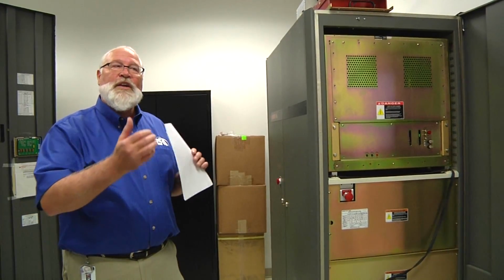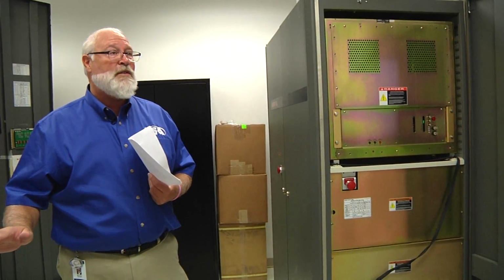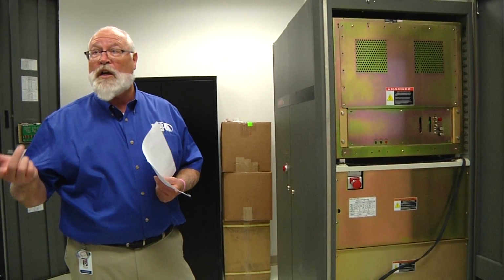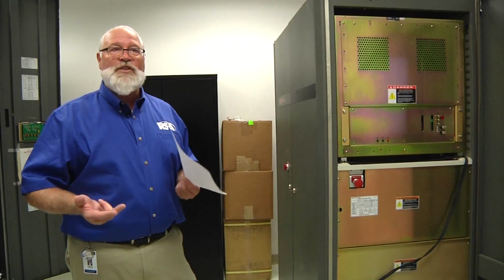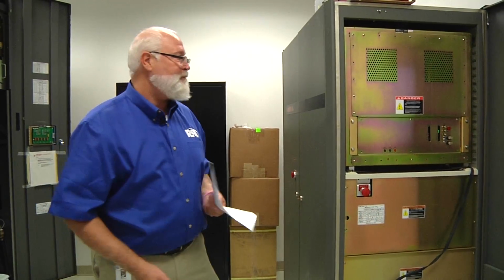And so a lot of times he'll have you look at stuff, you'll be his eyes, and he'll order parts before he even leaves to drive out here. So maybe those parts will be drop shipped, they'll be put on a plane, they'll get there that night. So sometimes we'll ask you to do stuff, but anything we ask you to do would be done safely.